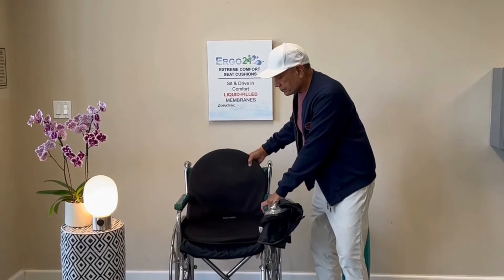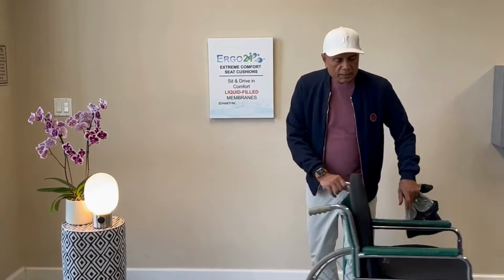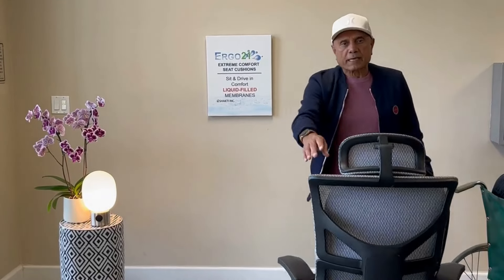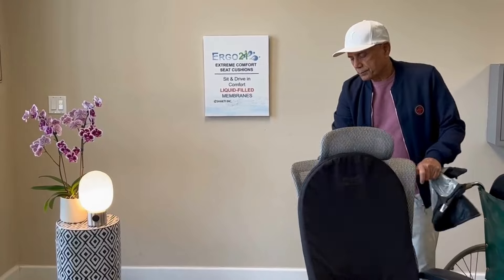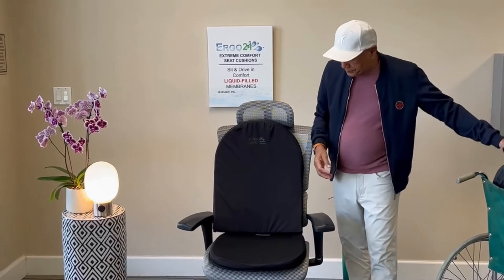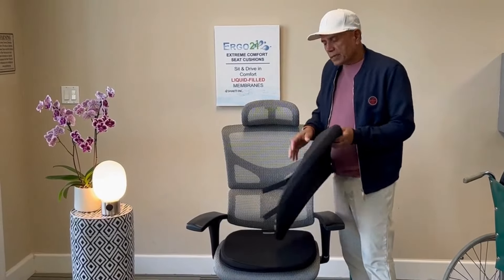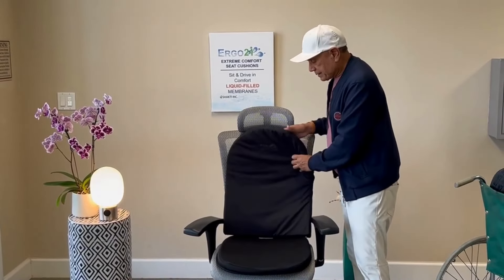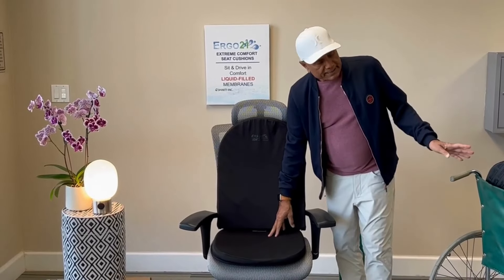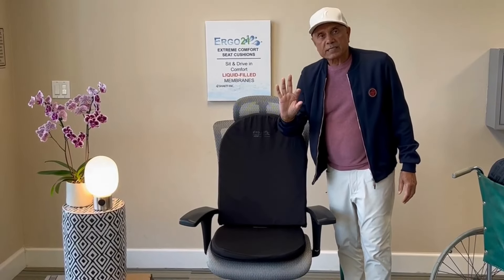For mobility scooters, we're going to do a demo on this chair that looks like a mobility scooter. Here we recommend the large lumbar, which has the strap in the back, and the original cushion, which is exactly like the travel cushion but two inches thick.